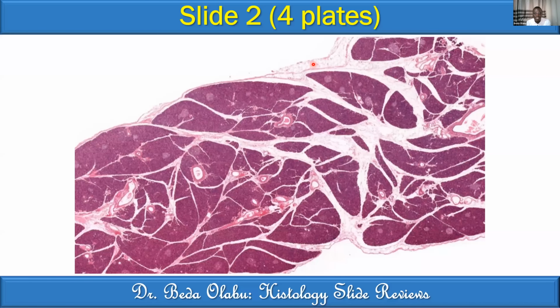It's very thin. It's actually surrounded by loose connective tissue. You can see that one. Thin, loose connective tissue surrounding the organ. And this loose connective tissue sends in septae or trabeculae, which seem to divide the organ into lobules. And both speakers have picked that the organ is divided into lobules.